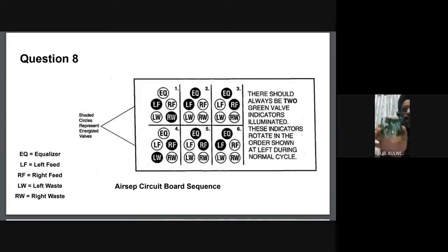So this is the circuit board used in the Elite or the Intensity machines. It is nearly the same. For basically testing that the machine is functioning fine, here are 5 LEDs. If you can see: 1, 2, 3, 4, 5.